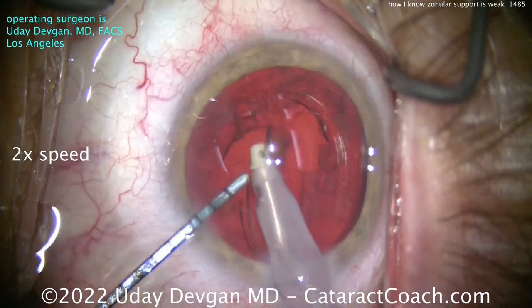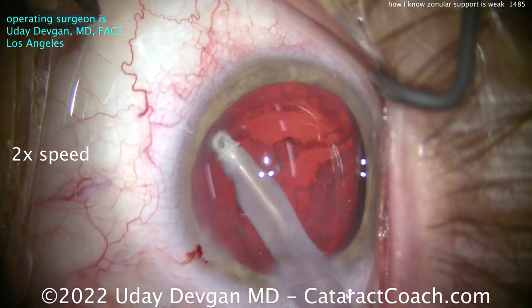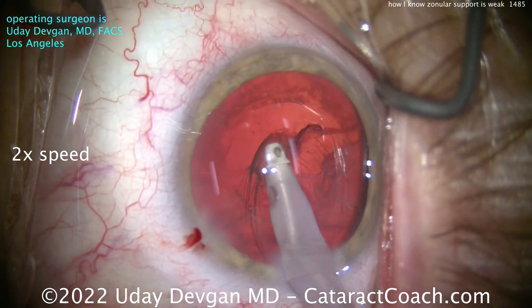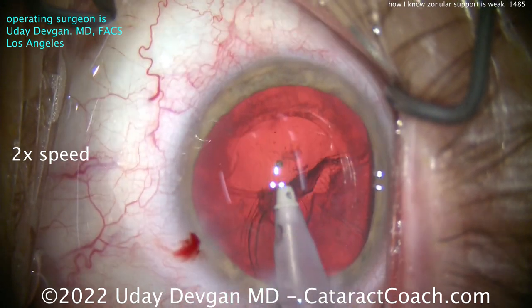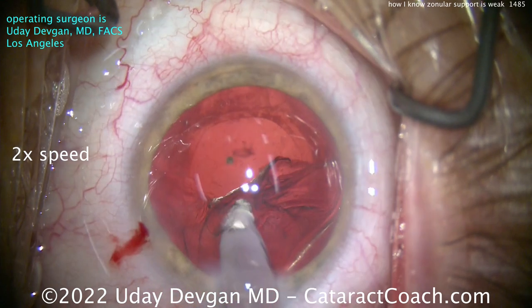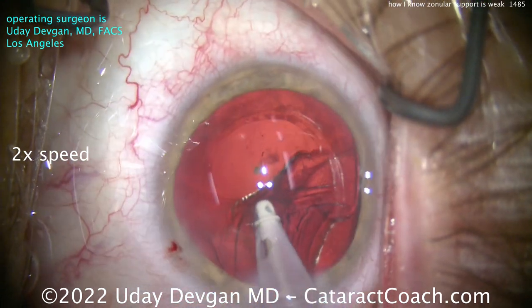Now watch carefully as I do the cortex removal. Get that one little nuclear chip pushed down. I'm looking carefully, doing the areas nice and slowly. What am I watching? I'm watching the capsular rhexis edge — that looks okay. But I'm also noticing the AC is getting a little shallower.